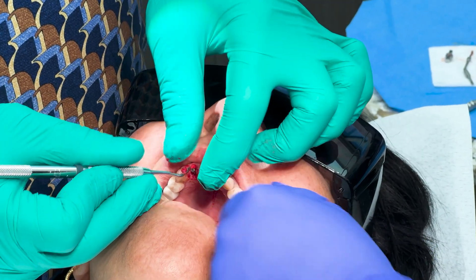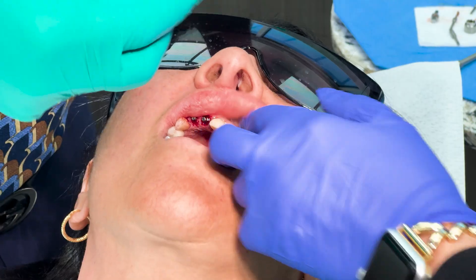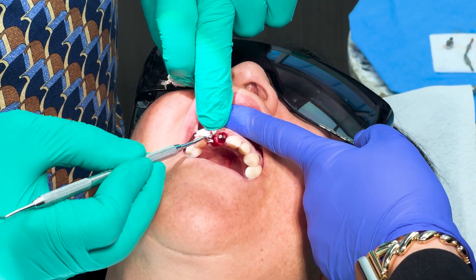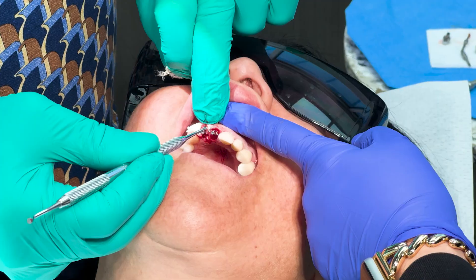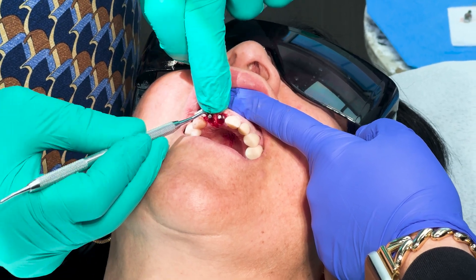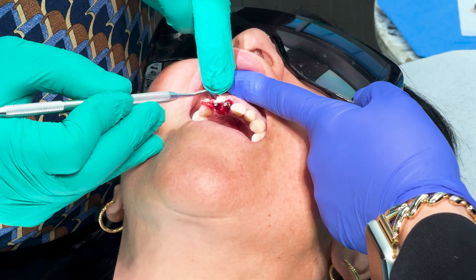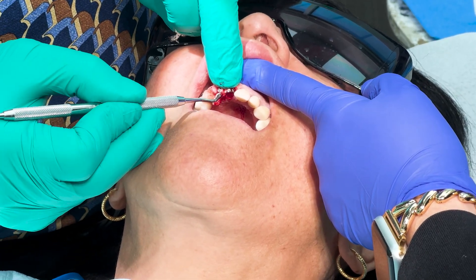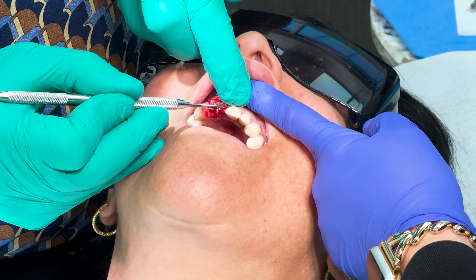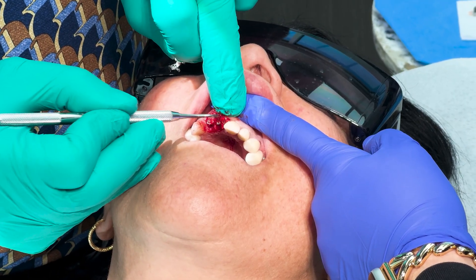In a matter of just a few minutes, we extracted two teeth, placed two implants, and now I'm going to put the hemostip, which I like to put over the top of the bone graft and around the implant — it will help to form a little bit of a clot and will help it heal. When it gets wet it tends to fall apart, but a little bit better.